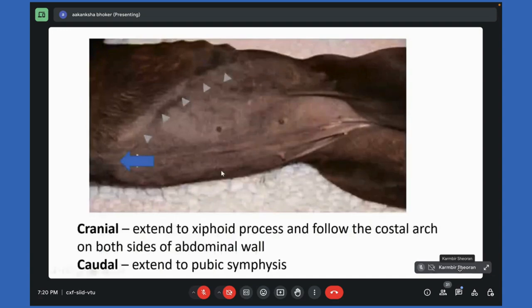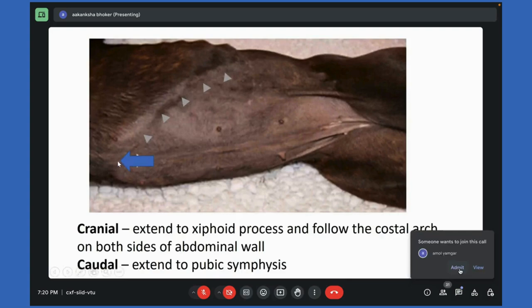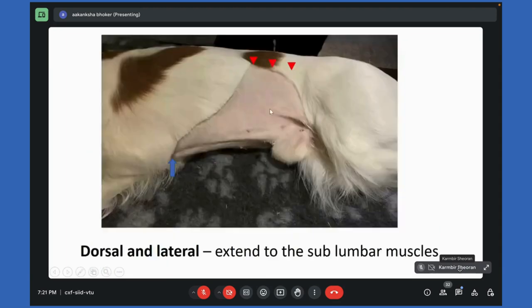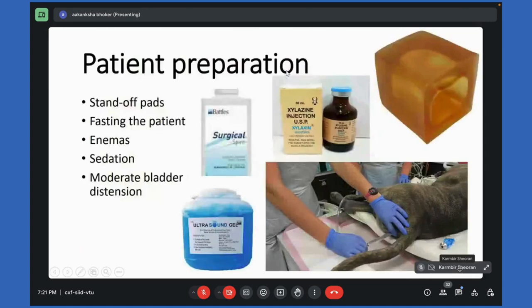So in this picture, we can see that enough area should be shaved. We can see cranially the shaving should begin from the xiphoid, and laterally it will continue along the costal arch. It will go up to the level of the sublumbar muscles, and caudally the shaving area will continue up to the level of the pubis. Similarly, the shaving should be done on the other side also. Here we can see that laterally the area should be shaved up to the level of the sublumbar muscles.